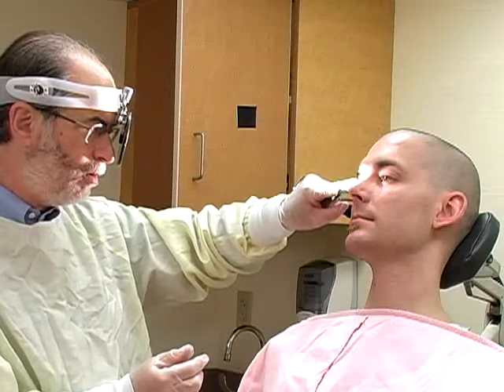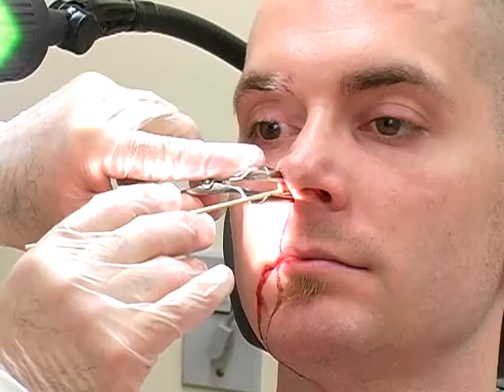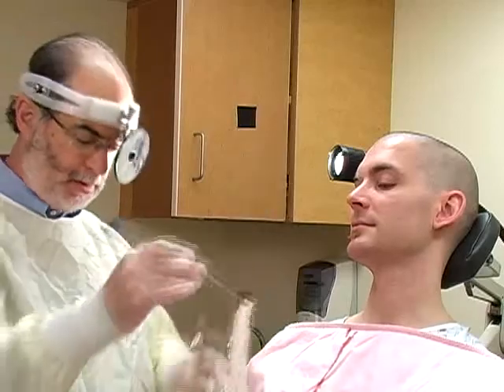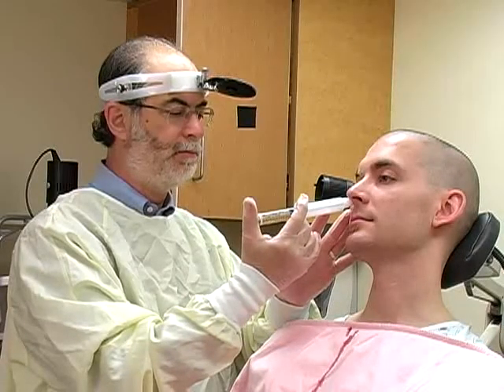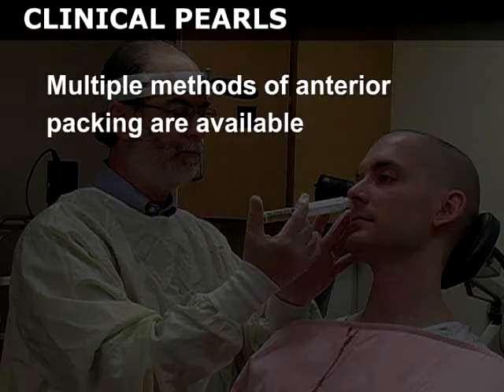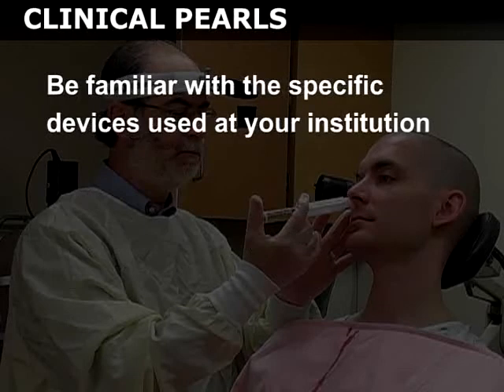If you are unable to localize the exact source of an anterior hemorrhage, or if silver nitrate cautery has failed, you will need to perform an anterior packing of the nose. Prior to any packing procedure, remember to apply a local vasoconstrictor and a topical anesthetic, as described in the preparation section. Multiple methods of anterior packing are available, several of which are reviewed in this section. The choice of anterior packing technique will largely depend upon the available equipment. Be familiar with the specific devices used at your institution.